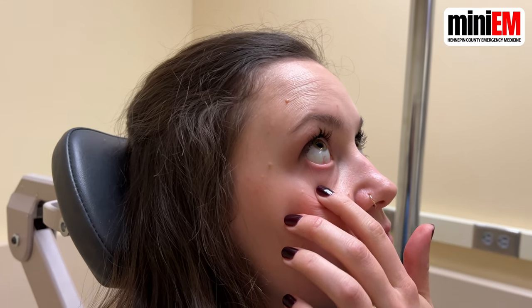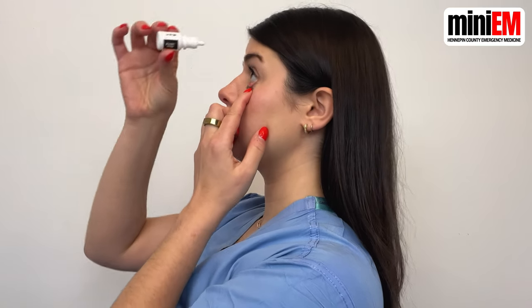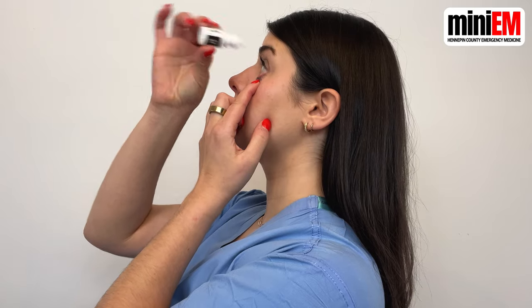Next, anesthetize the eye. Have your patient pull down their lower lid to expose the conjunctiva and give one to two drops of proparacaine or tetracaine into the lower lid of each eye. You'll have the patient look upwards while you're doing this to make it easier.